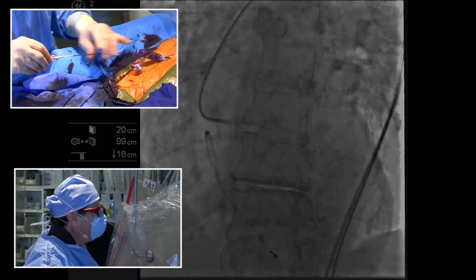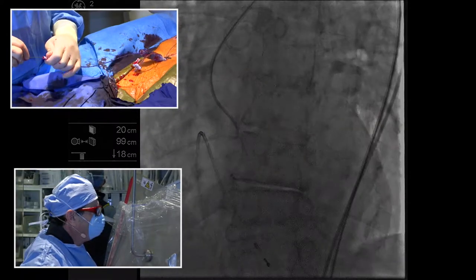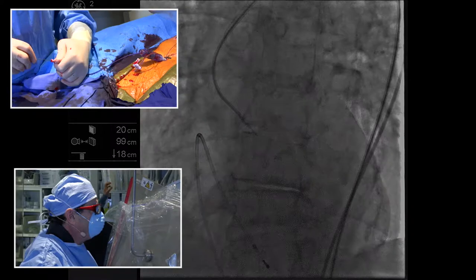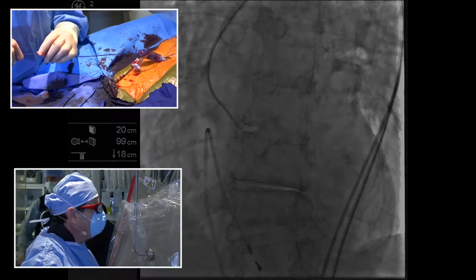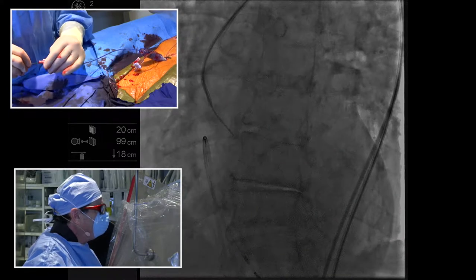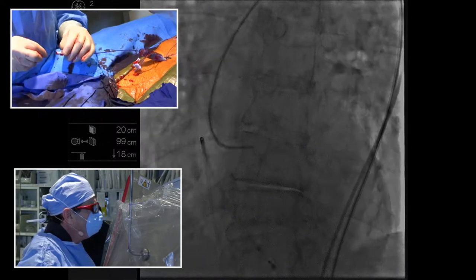So where is that jet? Let's see. This is interesting, huh? Yeah. It's somewhere around here. So there's two schools of thought here. One is to do it quickly so you can get lots of at-bats, so to speak, and the other is to do it kind of thoughtfully. So now I went from thoughtful to, all right, let's just start with this, let's get a snot wire in case it's that tight, and then we'll try a JR next.